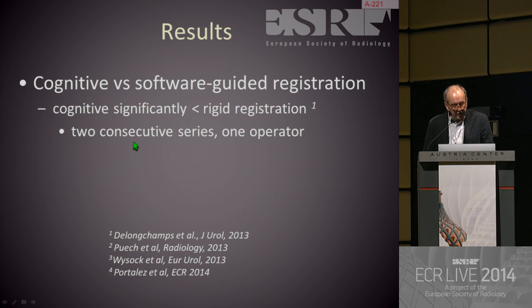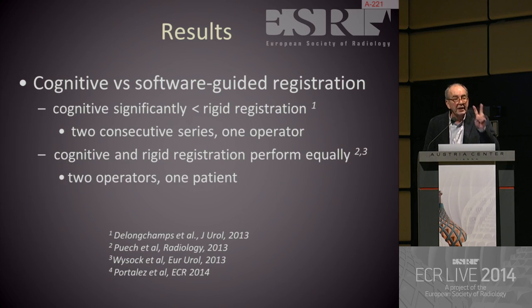So these results may be less valid than the 2 prospective studies reported in 2013, where 2 operators compared cognitive versus rigid registration biopsy technique, and showed that the brain and the machine performed equally.